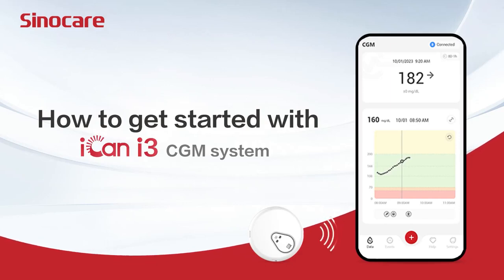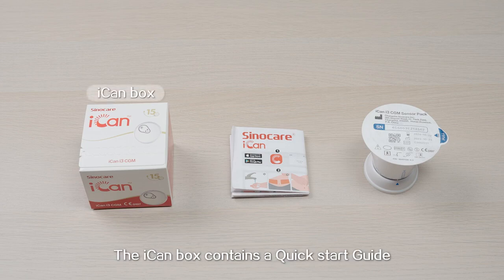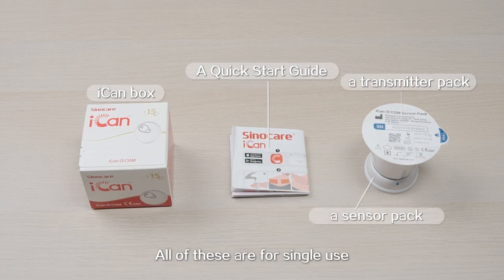How to get started with ICANN CGM? Getting started with ICANN is easy. The ICANN box contains a quick start guide, transmitter pack, and a sensor pack. All of these are for single use.